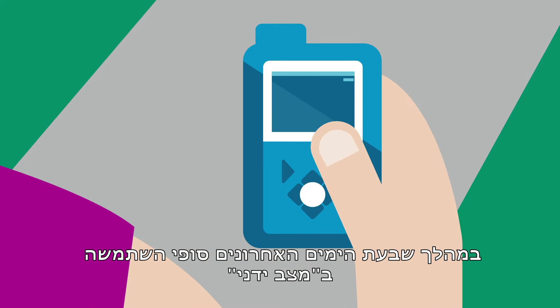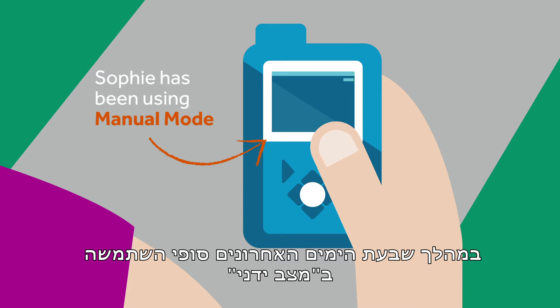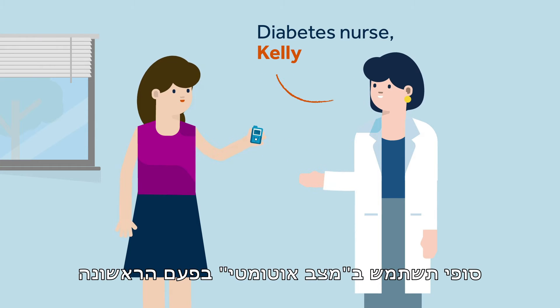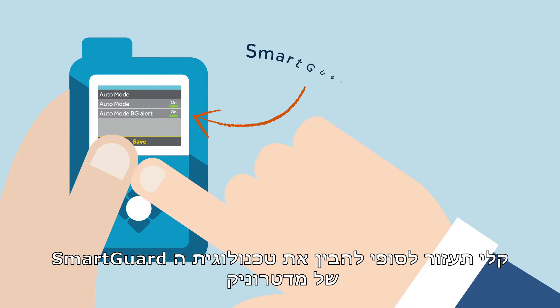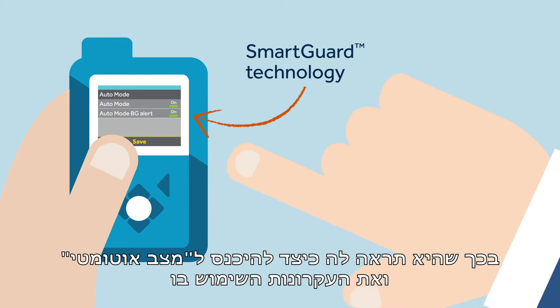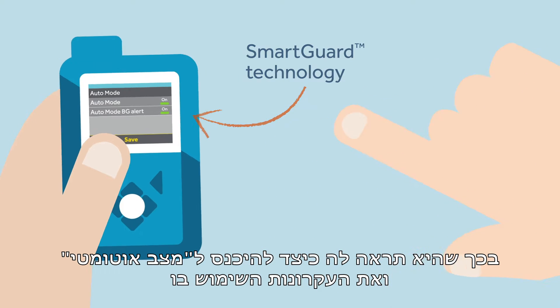For the last seven days, Sophie has been using manual mode. However, today, with the guidance of her diabetes nurse Kelly, Sophie will use auto mode for the first time. Kelly will help Sophie understand the SmartGuard technology by Medtronic by showing her how to enter auto mode and the basics of how to use it.